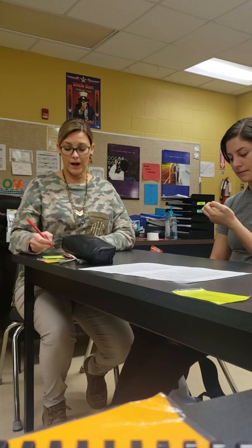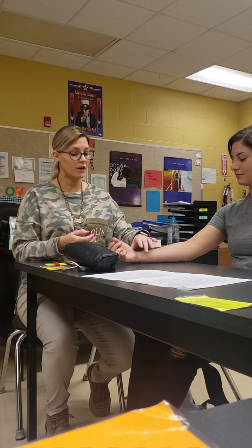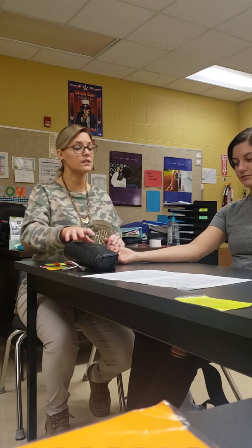All right. So I have my pulse and I have my respirations. Now what? So you already recorded it. Then with the resident seated or reclining, you're gonna lower the entire arm onto a flat surface. So my patient is sitting. If she wasn't sitting, I would give her the option to lie down if that was needed. All right, I'm gonna have you place your lower arm palm up on the flat surface. You're gonna expose the arm as much as possible.